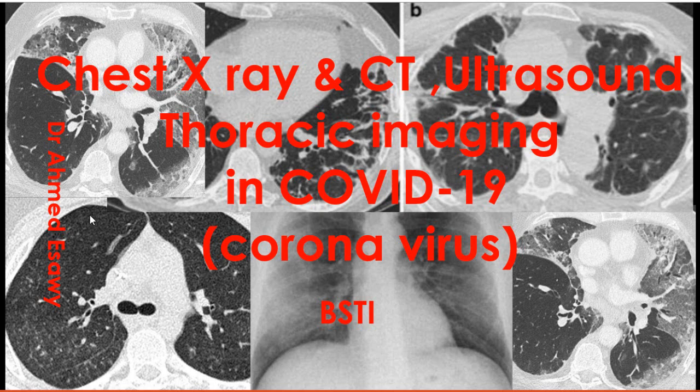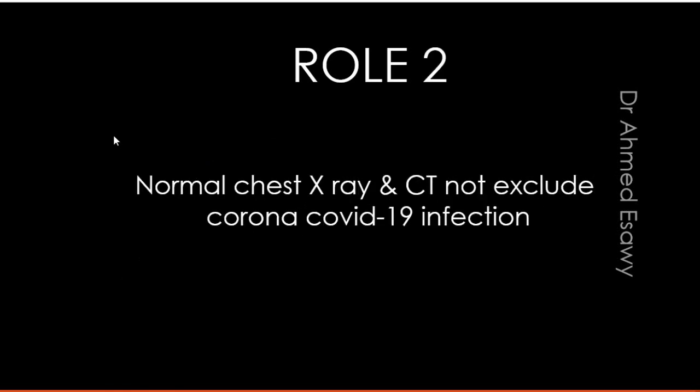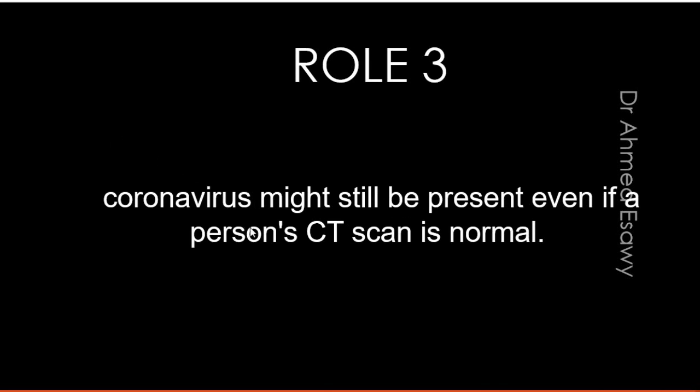Chest X-ray, CT, ultrasound, thoracic imaging in COVID-19 coronavirus infection. Rule 1: all signs of corona imaging are non-specific. Correlation with clinical picture is essential. A normal chest X-ray or CT does not exclude COVID-19 infection. Coronavirus might still be present even if the person's CT scan is normal.